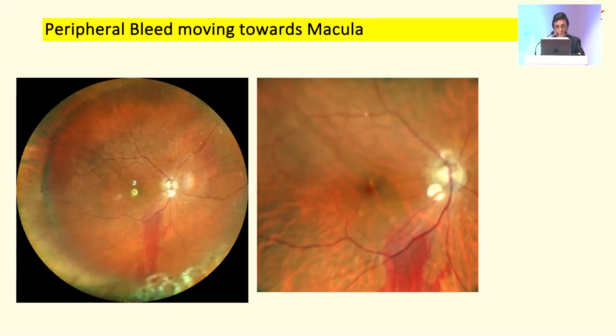This is how the patient looked post-operatively, and the macula looks fairly clear. The patient's visual acuity had improved to 6/12 one week post-operatively, and he is doing fairly well.